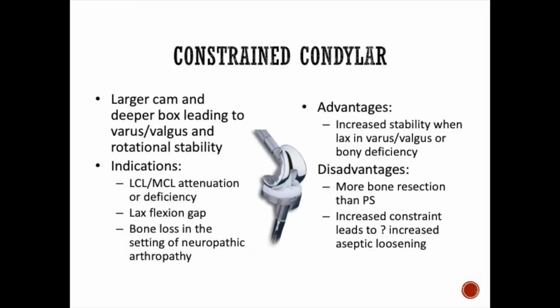It does involve more bone resection than a posterior stabilized, so revising these becomes extremely difficult and leaves very little bone behind. And the other issue is, because there's so much constraint now on that post, the post can actually fracture or have many other complications associated with it.